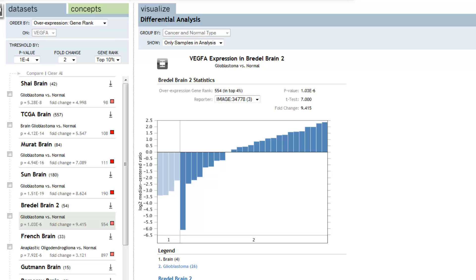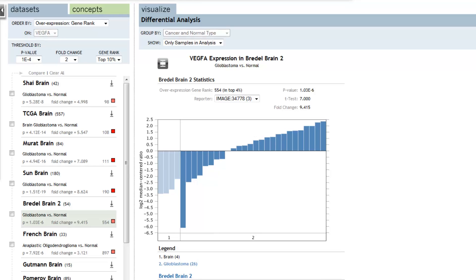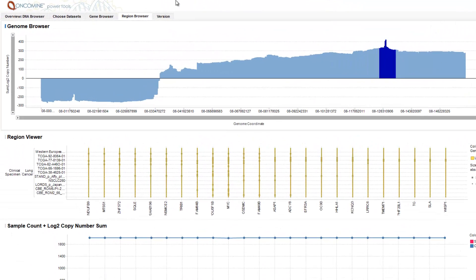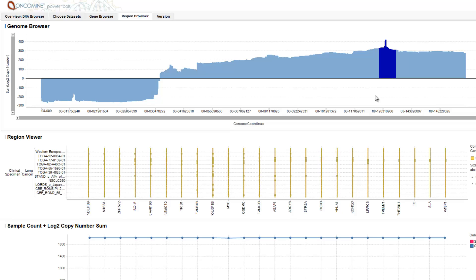Additional suites of tools provide more specific analysis related to the data that is being analyzed. For example, the Oncomine Power Tools suite provides the ability to drill down to investigate whether DNA copy number gain and relationship to cancer can be associated with a single gene that could be a potential target. Within the genome view, we can select chromosome 8, here summarizing across 5 lung cancer datasets. We identify a peak where we have a high sum of log 2 copy number across all of these datasets at a specific genomic location. We can mark the boundaries around that peak just by drawing a box around that region.